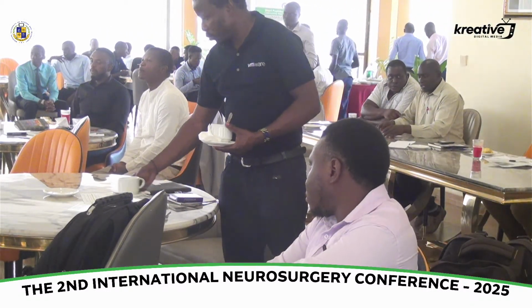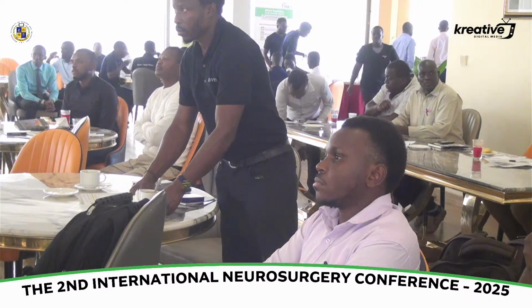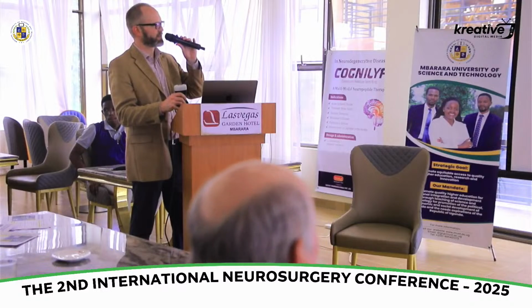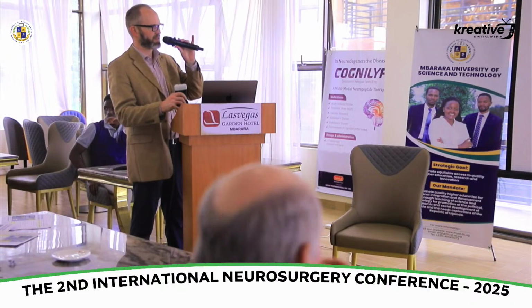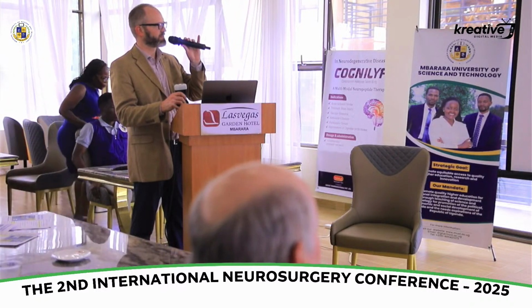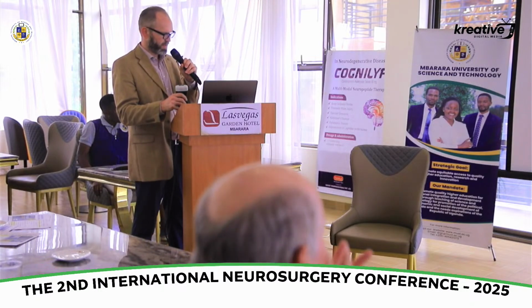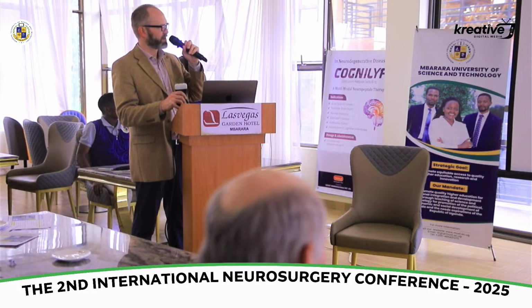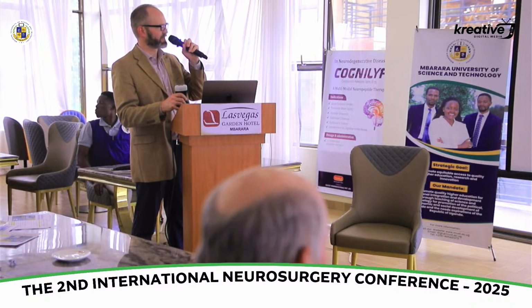There's the two lateral ventricles. So this model has hydrocephalus. Can you appreciate the lateral ventricles there? And the third ventricle, and then you can see those two bright areas at the base there, that's the anterior skull base, and the middle fossa floor on the lateral sides. And we come back, and now we see the third ventricle, and then we swing back, then you get into the brainstem.